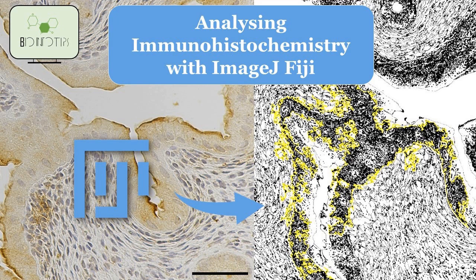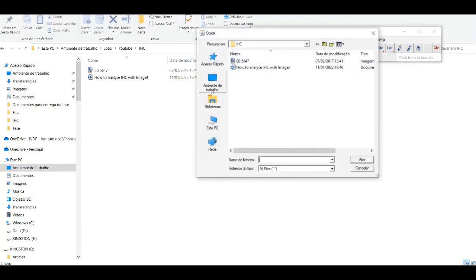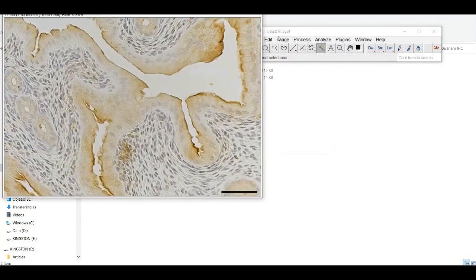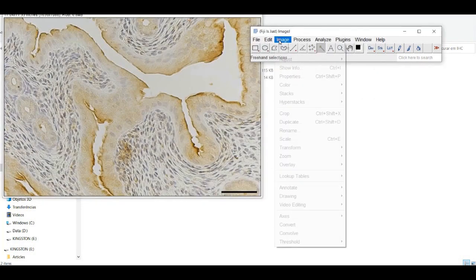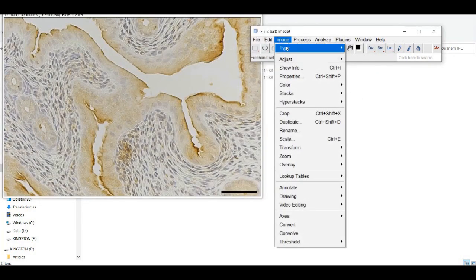Open the image in ImageJ and convert it to 8-bit grayscale. Create a color threshold to segment the regions of interest in the image.